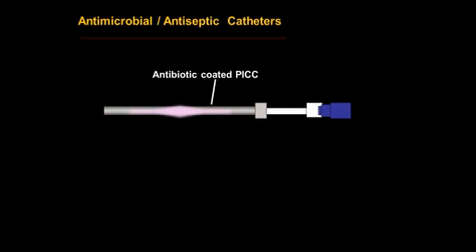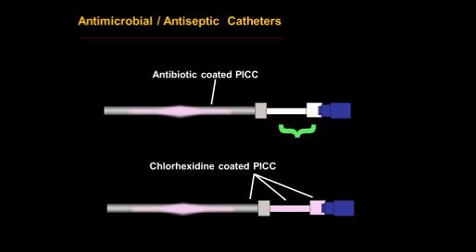So this doesn't talk about PICCs, but at the time these were written, antimicrobial PICCs were not in the picture. However, we do have antimicrobial and antibiotic PICCs available today. In relation to the antibiotic-coated PICC, it is both internal and external coated. However, one of the big problems with these devices is that they are not coated on the intraluminal surface of the little extension tubing and the catheter hub. This is a primary source of biofilm formation, as it is directly at the access portal.